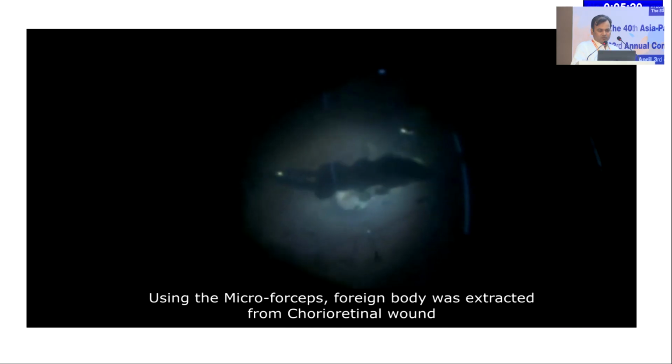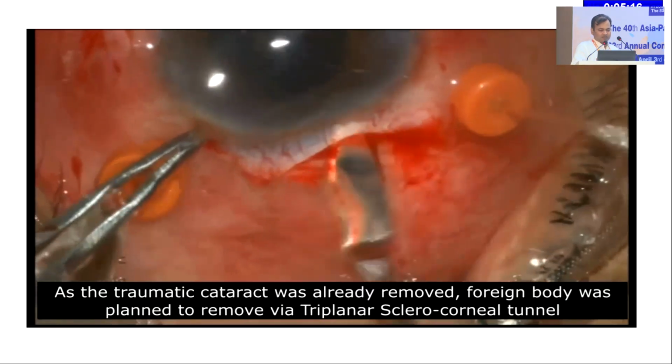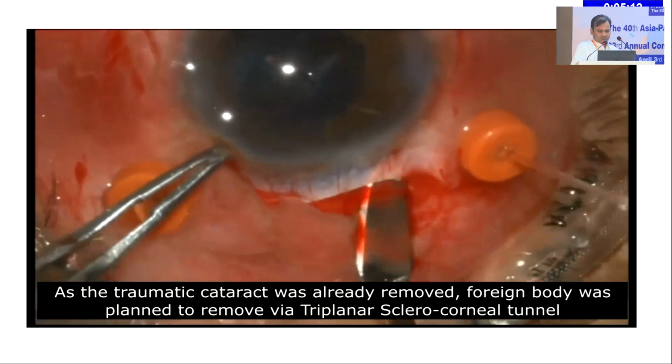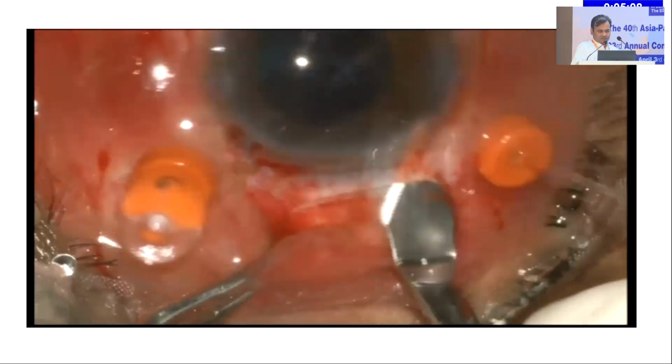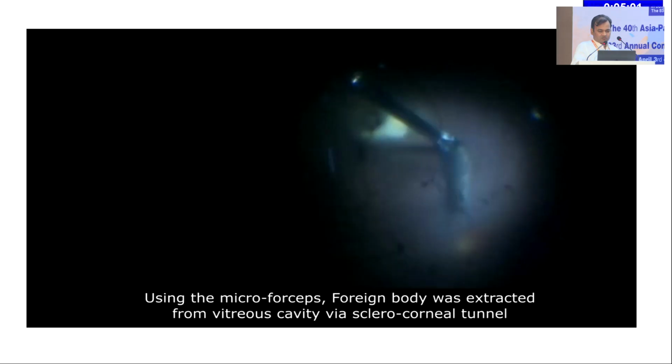So while removing these foreign bodies, you may create more tears and more detachments. The possibility is there. So taking care of all these points, I try to take it out, even though forceps are sometimes not able to grip, as the edges are not so fine.